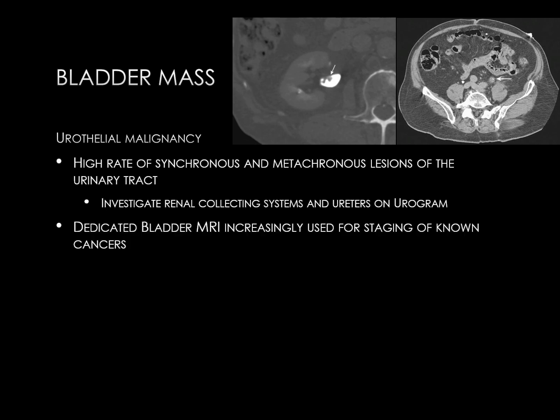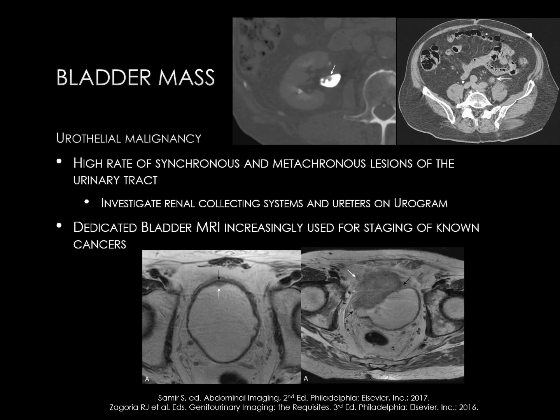A dedicated bladder MRI protocol is increasingly used for staging of known bladder cancers. At the lower aspect of the slide, on the left, we see a small bladder cancer at the anterior aspect of the bladder, indicated by the white arrow. The muscularis layer of the bladder, or the detrusor muscle, is intact, indicated by the black arrow, and this is a T1 stage tumor. Conversely, in the right lower image, there is a large bladder mass which is growing through the muscularis layer into the perivesicular fat — this would be a T3 stage tumor.